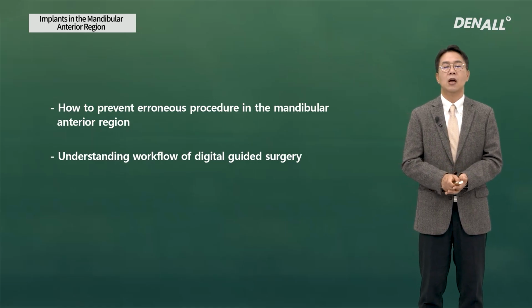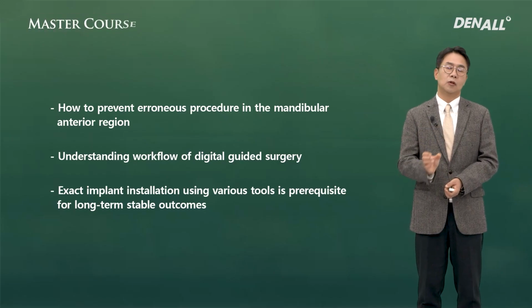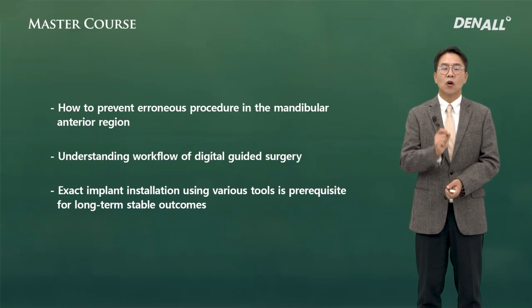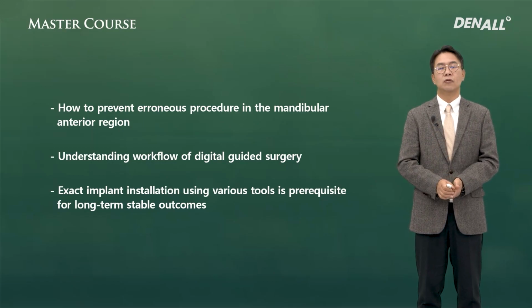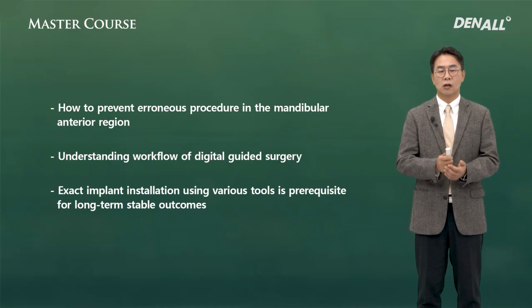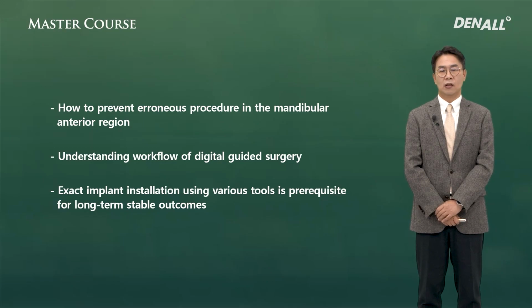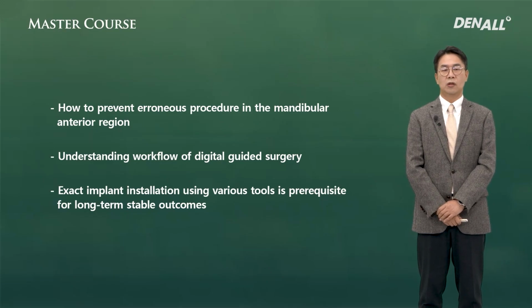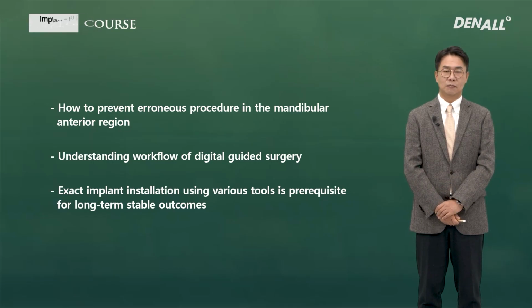The most important thing for mandibular or maxillary anterior is the accurate drilling. So various instruments, tools need to be utilized for long-term implant stability, and I hope you can utilize them.